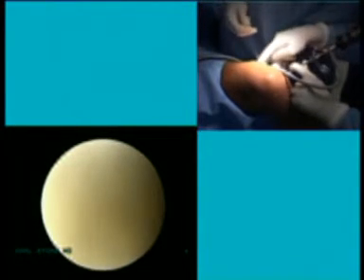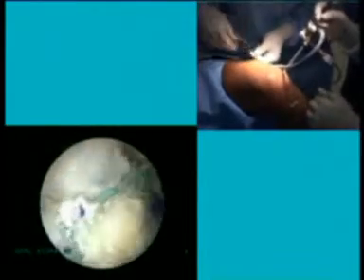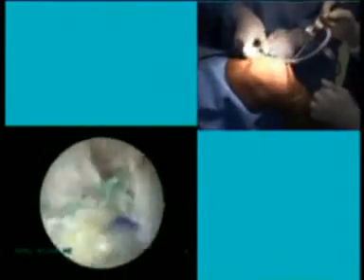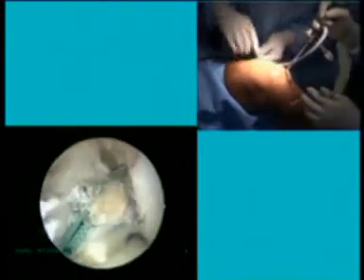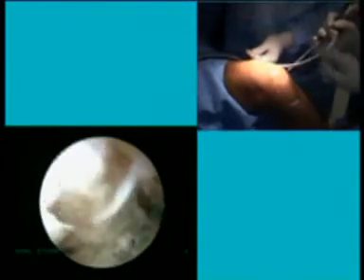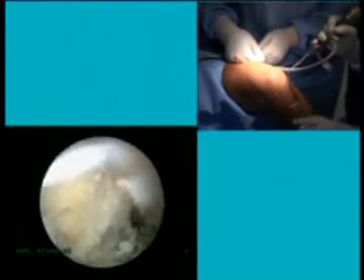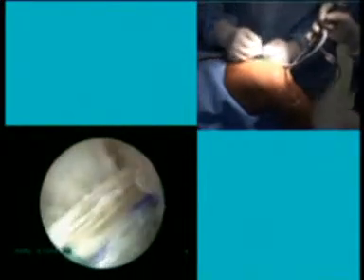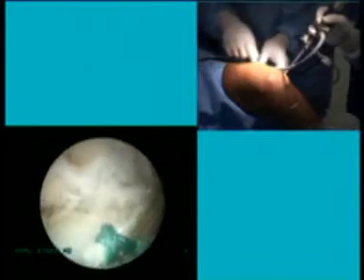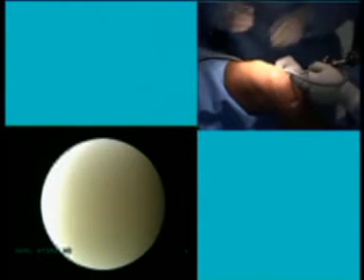So have you flipped the flip tack, Dr. Peterson? Have you passed both the grafts? Yes. But we have a problem. I don't know what happened there. What's the nature of the problem, Dr. Peterson? The nature of the problem is that we pulled the whole graft out of the femoral tunnel.